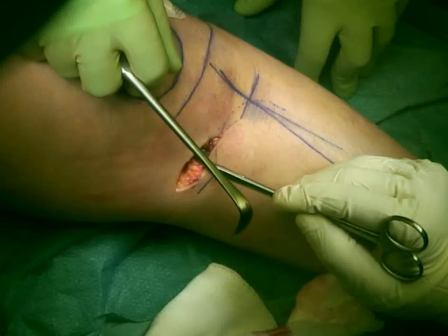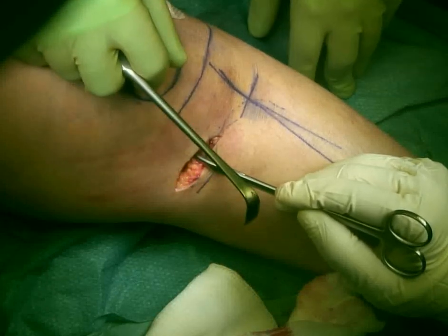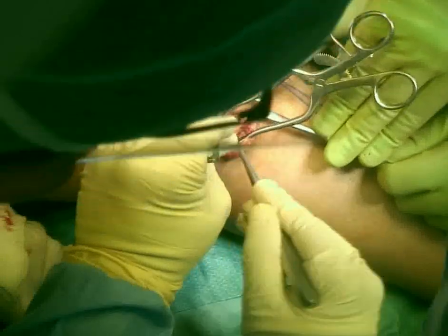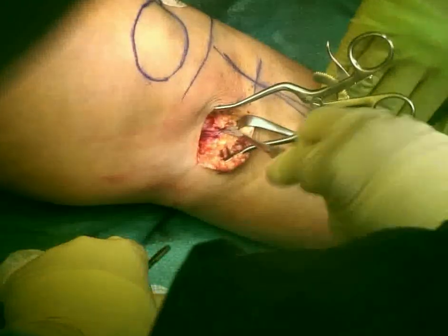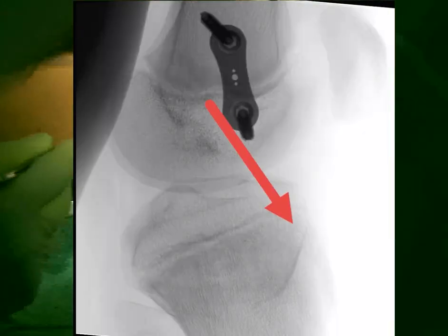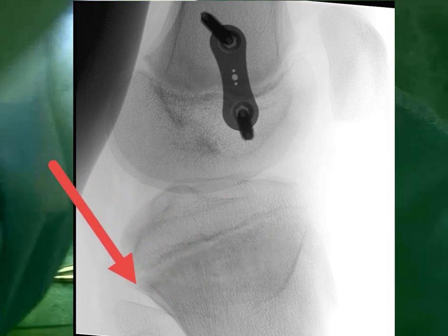Now I reach the axilla of the depressed hemiplateau. I put the tip of my scissor there and I x-ray. And when I'm happy with the position of my scissor or my entry point, I'll go subperiosteal. I'll try to peel the periosteum from the area where I'm going to do my osteotomy. It's essential at this stage to reach and map the whole depressed hemiplateau from the front and the back, and being able to pass your finger in both directions.